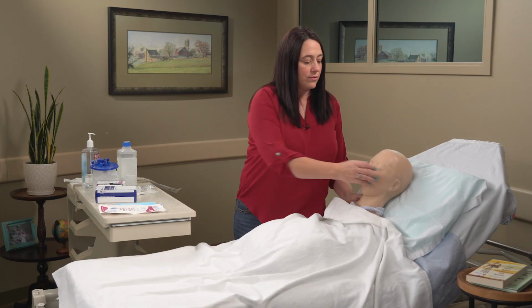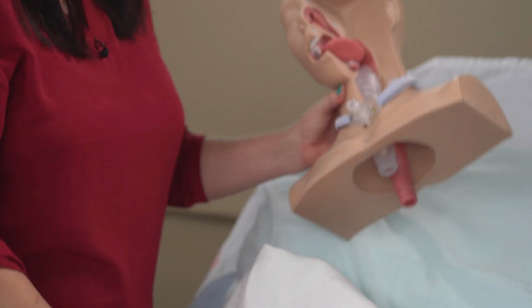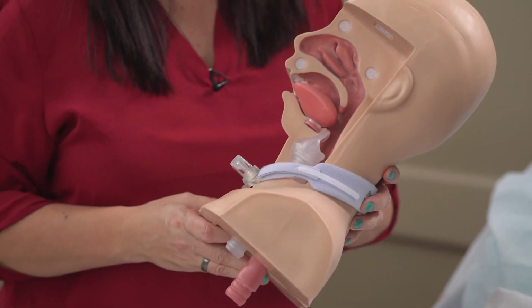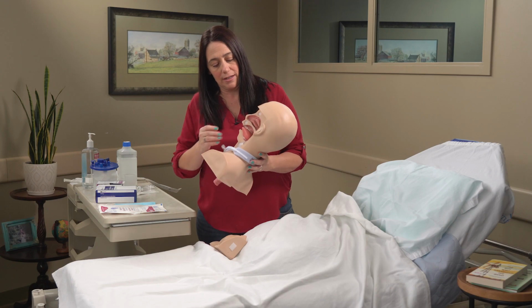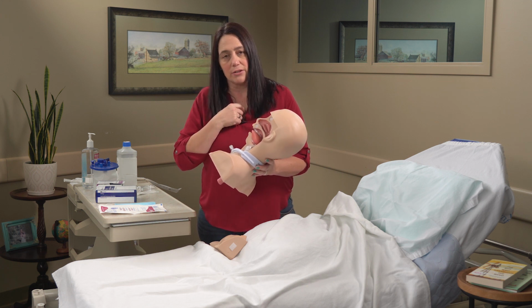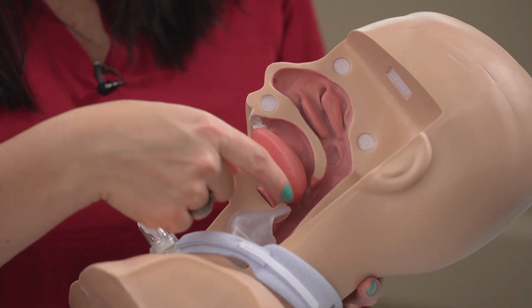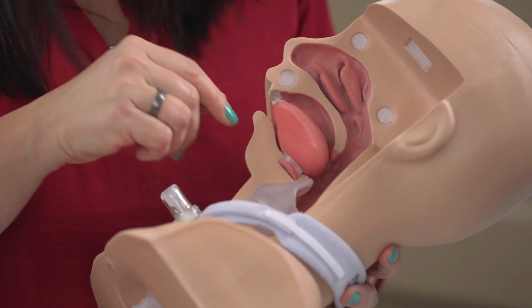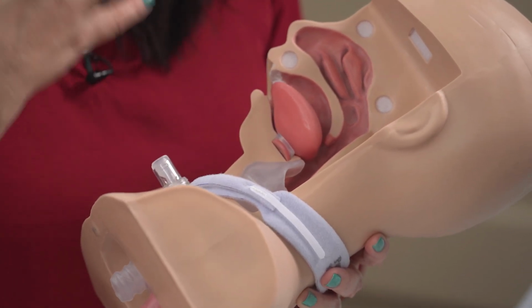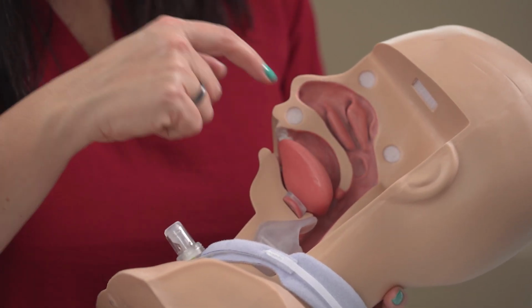What I'm going to show you now is how this looks when the process is impeded for a person and what's going on for the need of a tracheostomy to be placed. As we can see in our medical mannequin here, if a person ends up needing a tracheostomy, it's because something went wrong in that upper airway. It could be that it got swollen to the point where it was completely closed. The tongue could swell to the point where it's blocking the airway, or there could be some other issue causing a blockage up above.